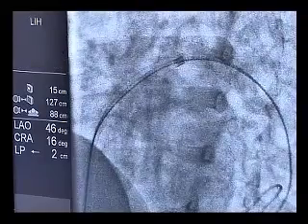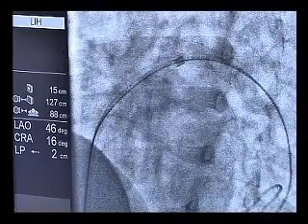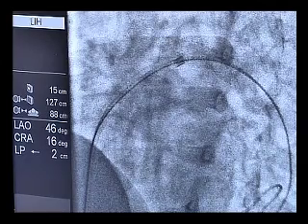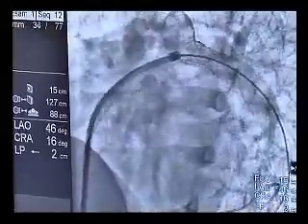Because I come from a deprived country, I'm not used to a pre-mounted stent that you can double its size after you put it in. So what's the maximum size you can make the pre-mounted stent? The maximum size we can dilate this stent is 18, and I think it should be good for the baby.